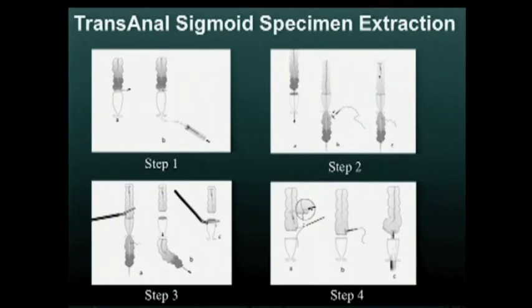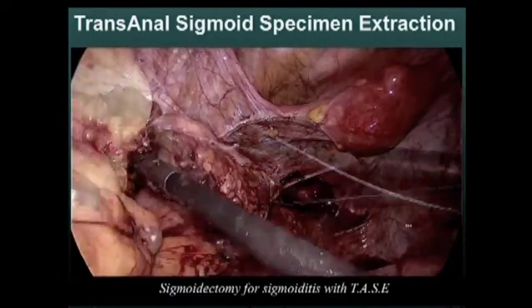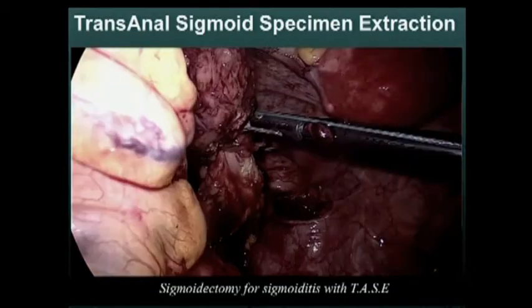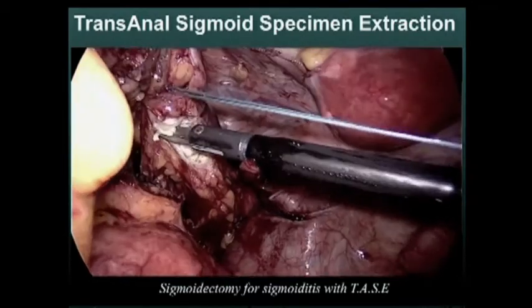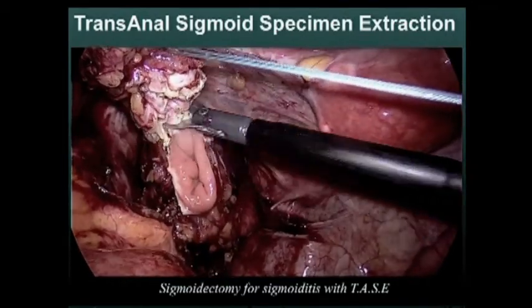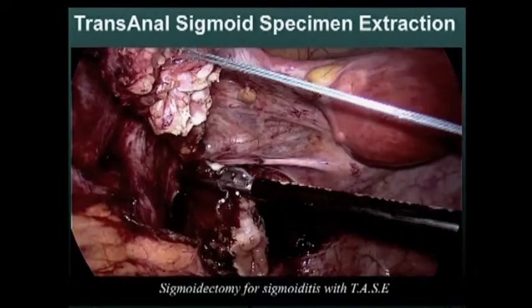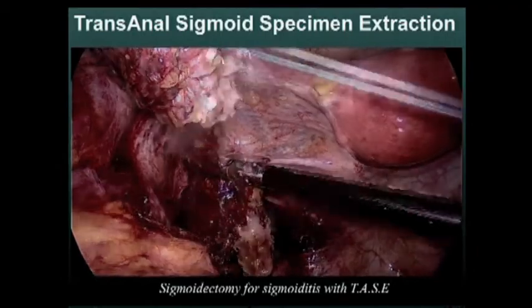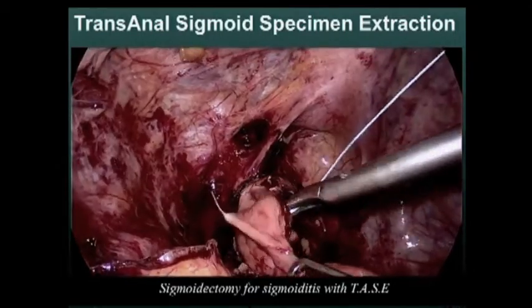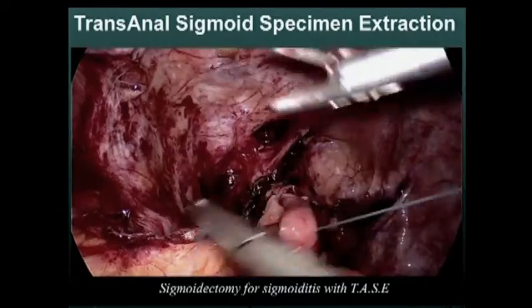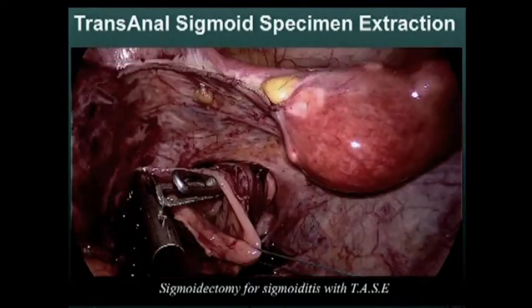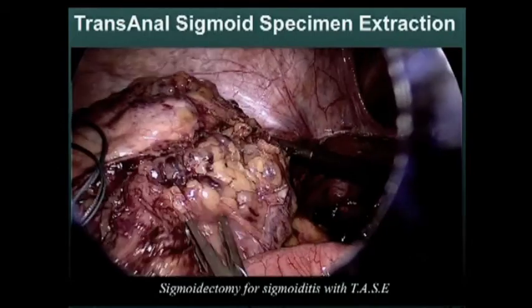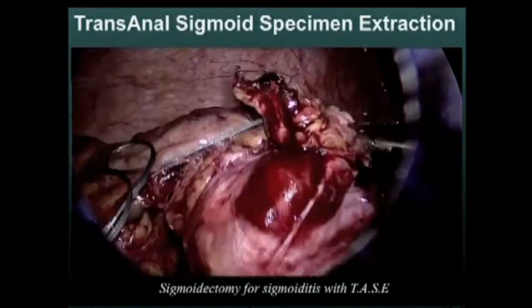The technique involves ligation of the distal colon, as shown in the video. We divide the meso, mobilize the sigmoid, and ligate the low sigmoid with extracorporeal sutures. After cleaning the rectal stump with betadine solution, we divide the colon just above the colorectal junction. We then suspend the rectal stump through a trocar and introduce a forceps to grasp a loop positioned at the extremity of the colon.